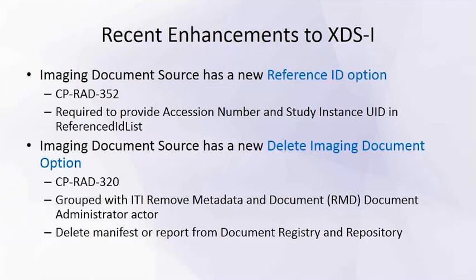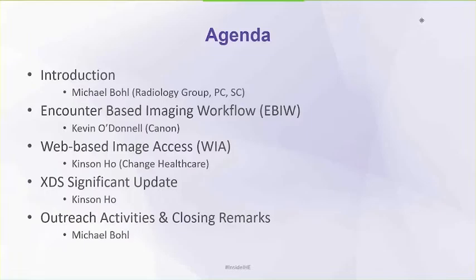In the past, there was only abstract wording in the profile, but no specific details about it. So there were lots of different implementation variations in the field. Now we have a more detailed, concrete option that you can use to handle the study deletion and propagate that logic to the XDS environment. So that's it for me for the update on WIA and enhancements on XDS-I.